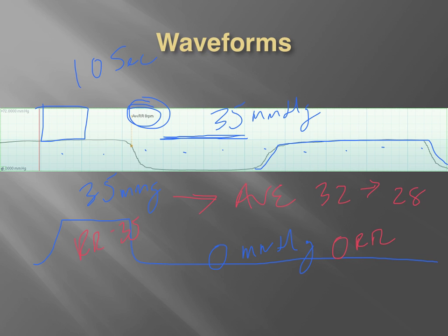So this becomes particularly important when we're confirming tube placement, whether that's a patient that we're performing CPR on, or if they have their own pulse still and we're doing some type of rapid sequence intubation. We're always doing tube confirmation and ventilatory status confirmation based on waveform. Okay, we're not looking at just numbers. Numbers do come into the picture, but waveform has to confirm ventilatory status first.